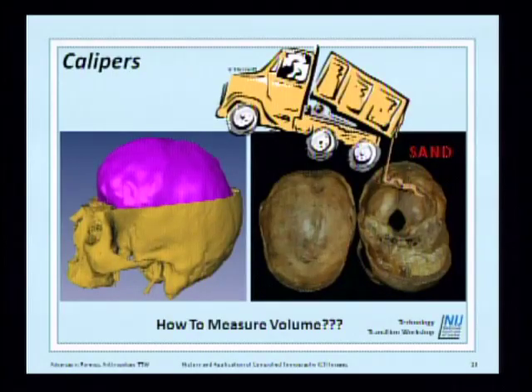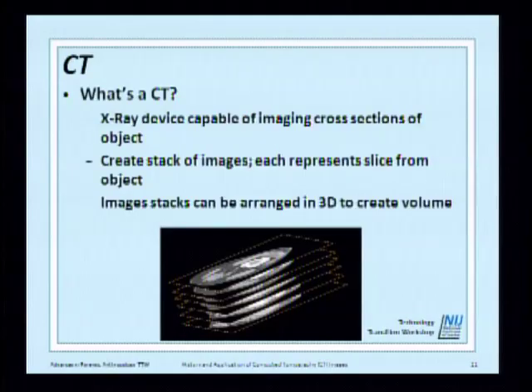Of course, this is a slide showing you how you do measurement by putting sand, but actually you can do it the same way with a computer, with a little bit of computer engineering. You can get the same results with actually higher accuracy. Now, what's CT? Probably a lot of you know CT very well, but I'm going to explain here how we use CT. And also, when we use CT, we come with another set of problems. I want to explain it a little bit and how we came around this problem.